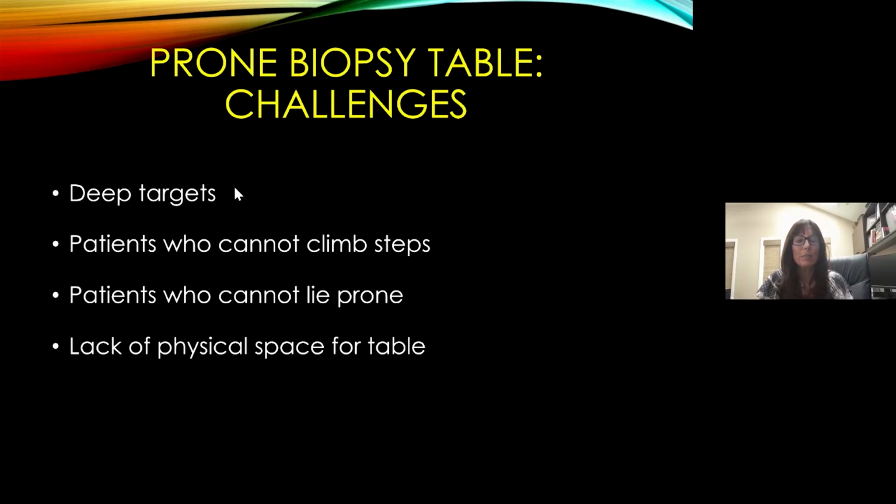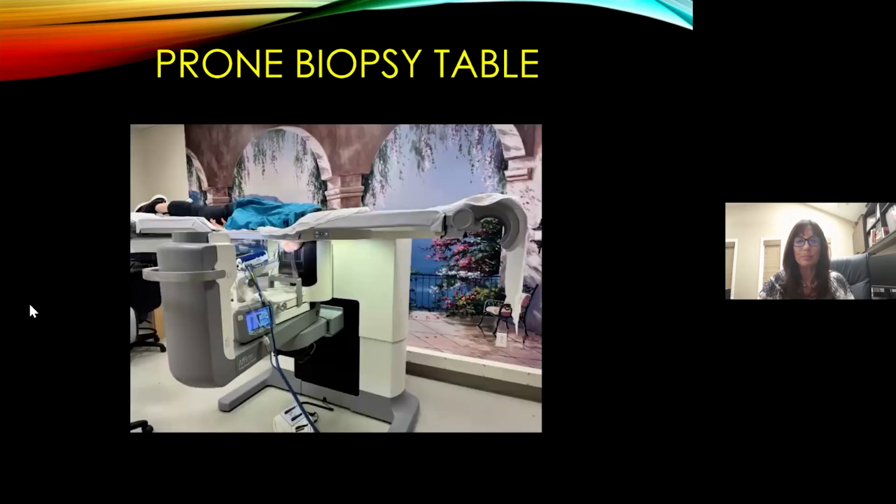Other challenges besides a thin breast would be targets that are very close to the chest wall, patients who may not be able to climb steps to get onto the stereotactic core biopsy table, patients who cannot lie prone, and perhaps lack of physical space for a prone biopsy table.